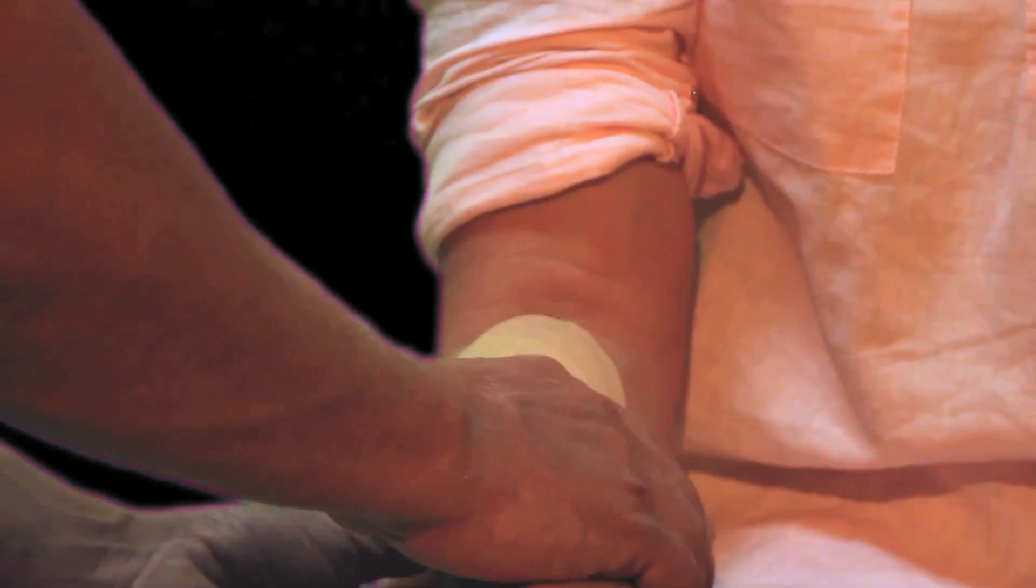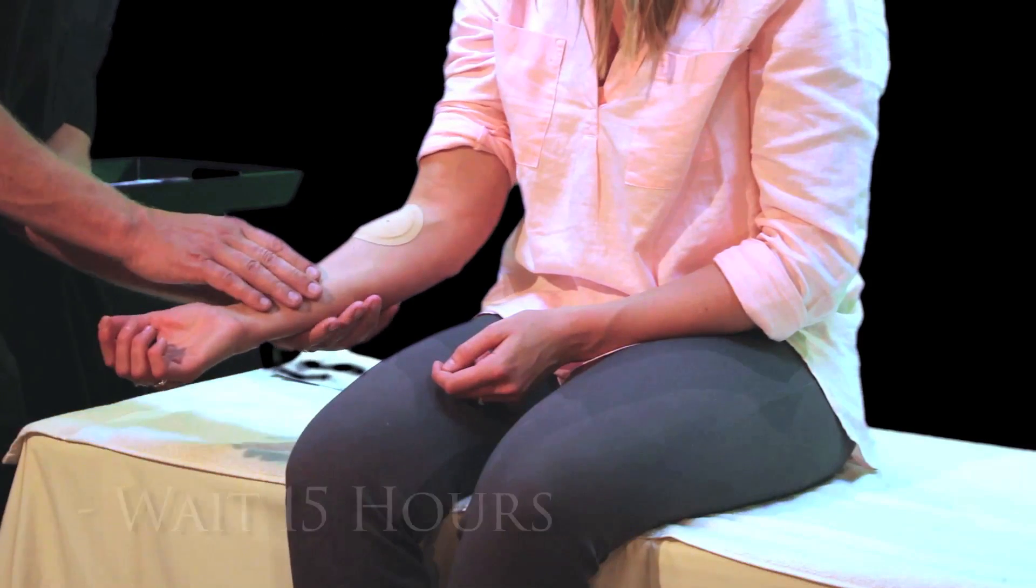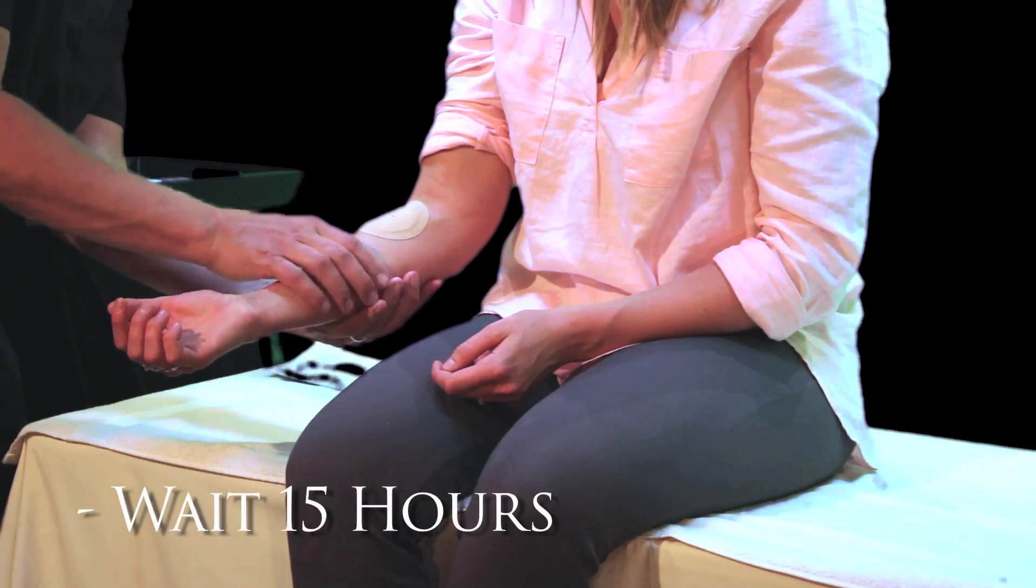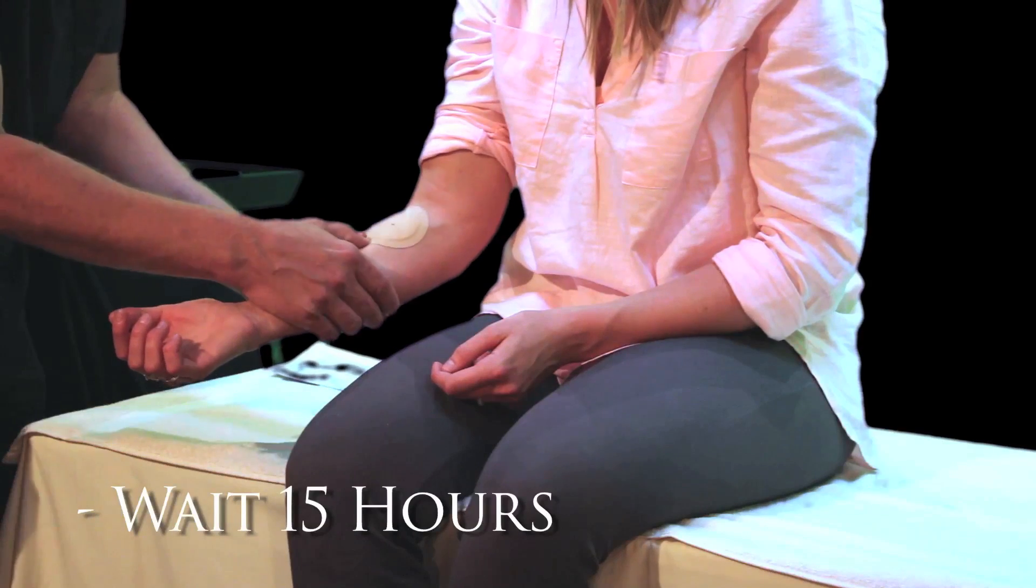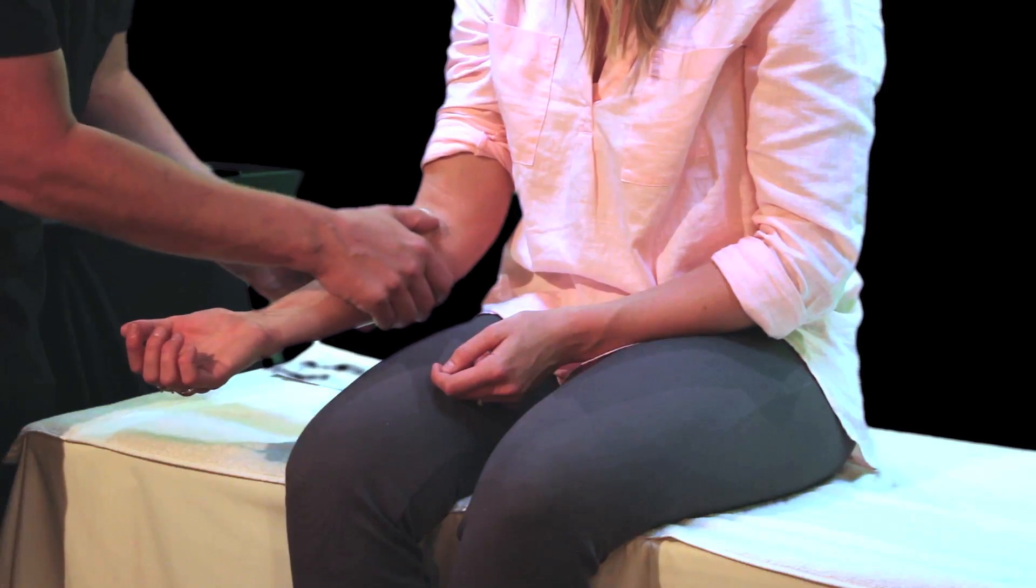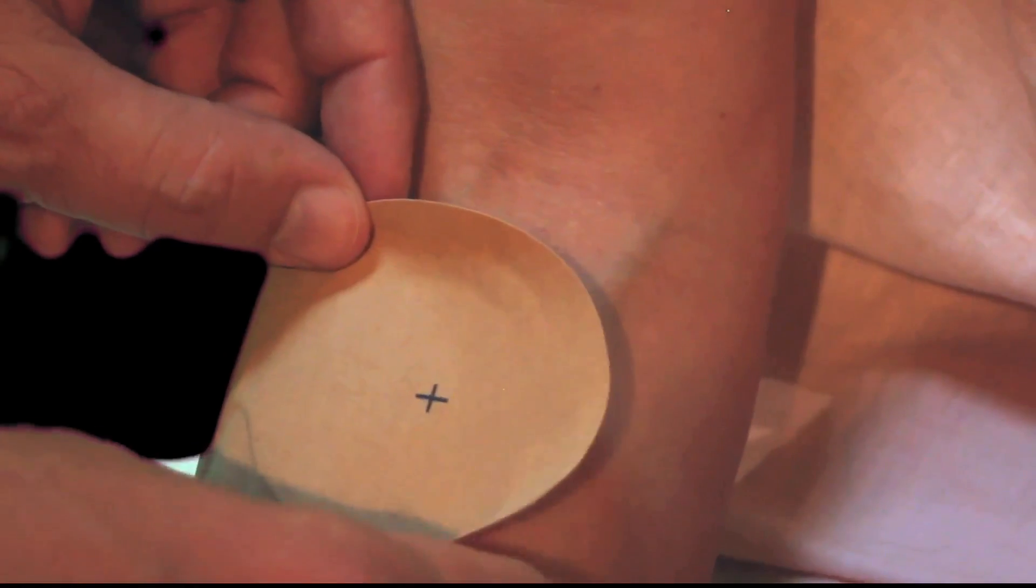For the average patient, dosage delivery will be complete in approximately 15 hours. After the 15 hours has been completed, you would want to remove the patches.